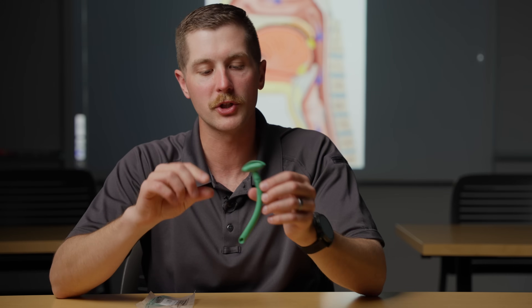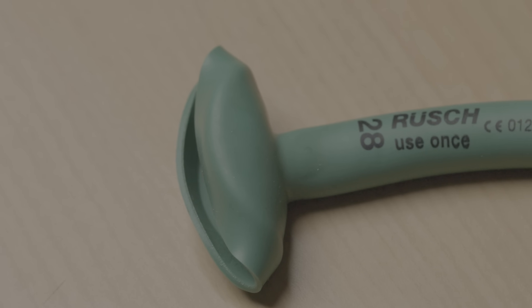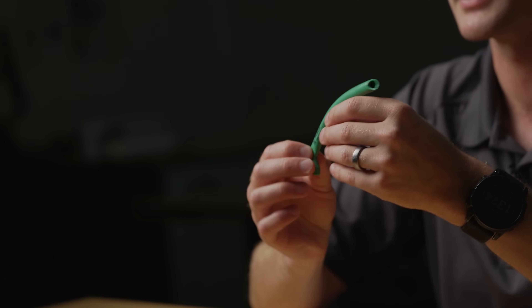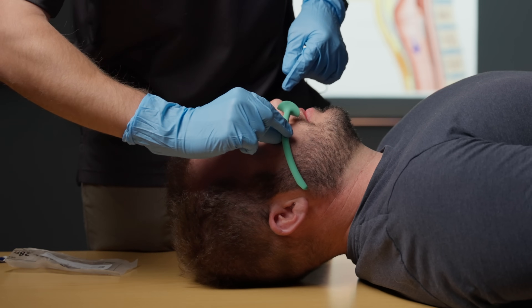Talking through the parts of an NPA — we do have the sizing right here. A majority of your middle-aged male patients are going to be a 28 French, which is the most common size and probably what's in most IFACs you purchase online. These do go very small and very large. They are sized by placing the tube between the base of the nose and either the angle of the jaw or the earlobe, depending on who you talk to. The sizing can be a rough estimate, so if it's not perfect, don't worry — it will still function. But if you're at extremes on either side, you may want to go up or down a size.